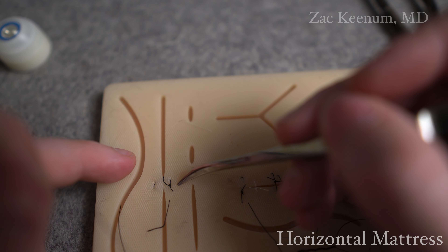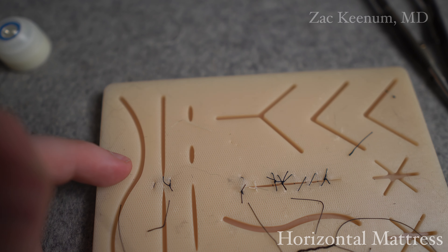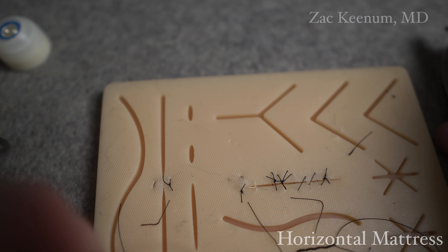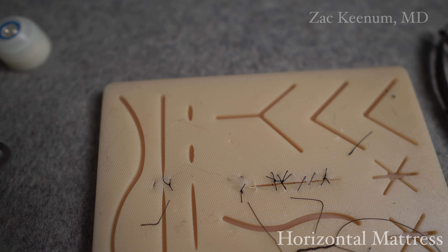With this one, we kind of made a box with our horizontal mattress. You can actually do a running horizontal mattress where you keep it running. But that's the basics of the difference between the two.